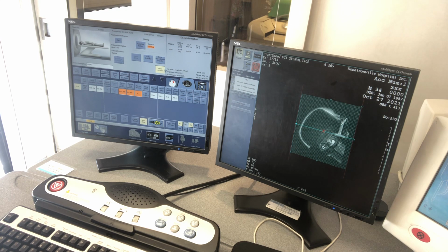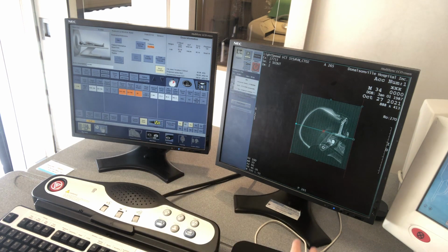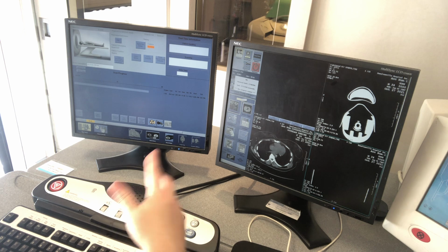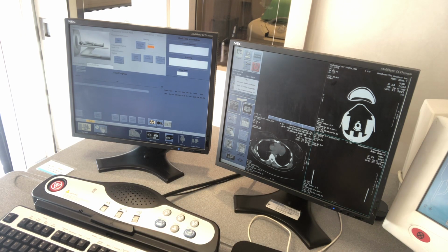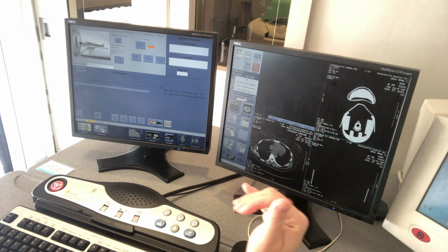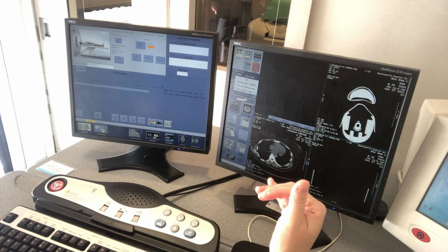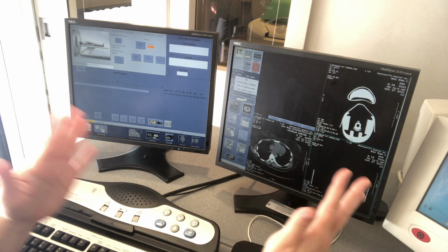So always make sure you show the localizer, you check the localizer or your scout for each one of these down here that is highlighted. So once we have everything, you'll hit confirm. And it's going to go back through the process. You move your table, you hit start, and it's going to scan again. Or you could have found your numbers, your reference points on your scout, the localizer, and you could have entered them over there. But just to make things simple, let's stick with this.